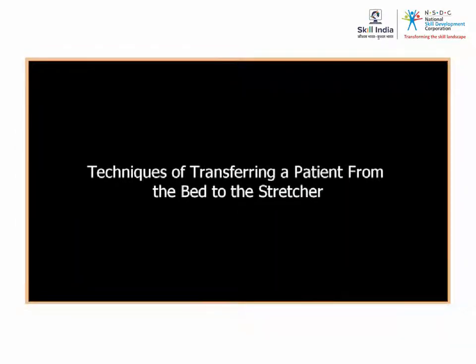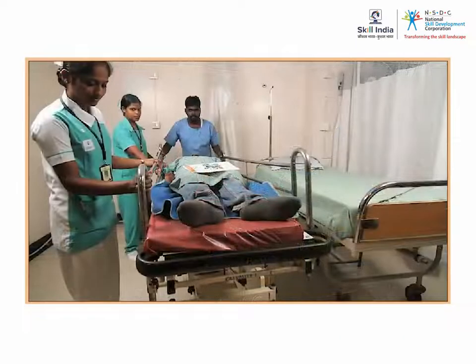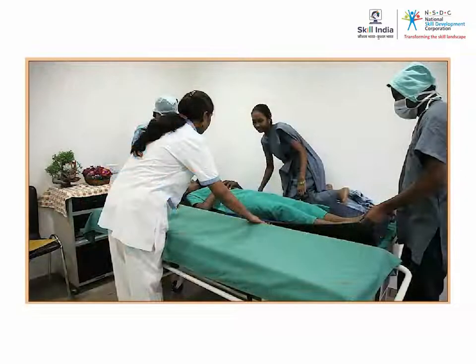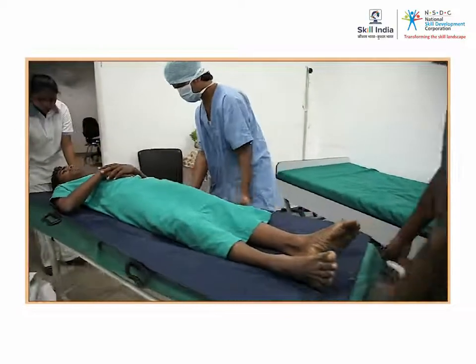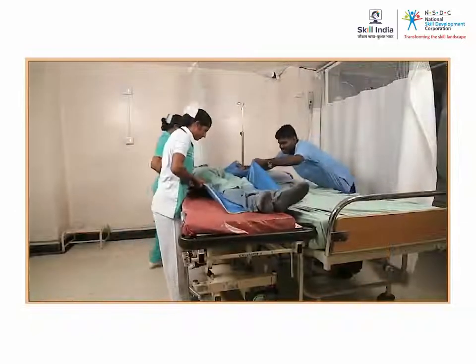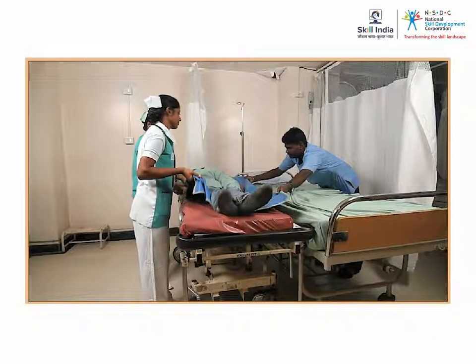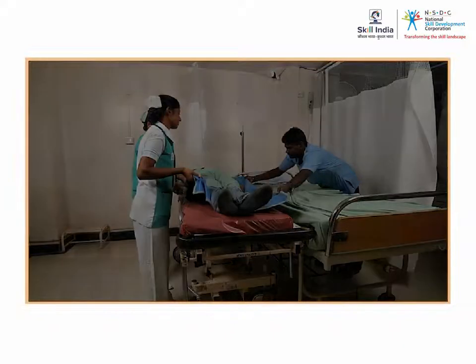Techniques of transferring a patient from the bed to the stretcher. During the stay in the hospital, a patient may have to be moved from one ward to another for various procedures. Before you transfer the patient, you must plan the procedure by collecting information about the patient's condition from the nurse. The steps involved in the transfer of a patient from the bed to the stretcher are as follows.